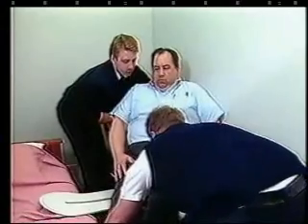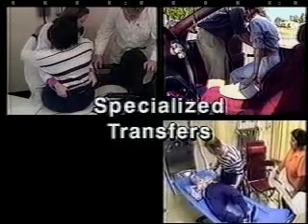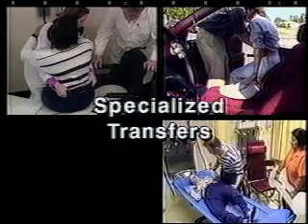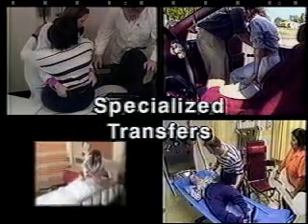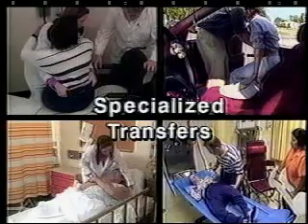The Beasy is designed to work in a number of specialized circumstances, such as when the wheelchair arms are not removable, or when you wish to transfer in or out of an automobile, or when the patient begins in a supine position, and when you wish to use the Beasy to boost a patient in bed. In this segment, we'll explore those specialized transfers.